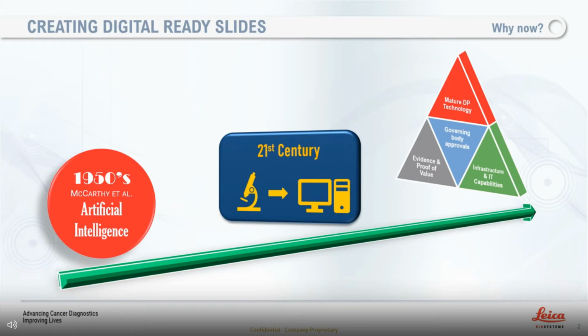And really that puts us in a position where now we're starting to see the development of artificial intelligence-based tools for usage with digital pathology. And really the input to any development of an artificial intelligence-based tool for pathology is going to be based on those digital pathology slides. And that gives the whole requirement and the need for having digital ready slides.